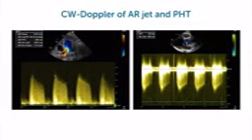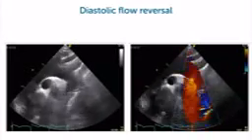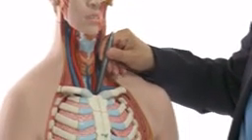The shape of the spectrum of aortic regurgitation plays a role, and also what we call the retrograde flow that comes from the aorta back into the left ventricle, which can be assessed by a view which is called the suprasternal view. We just want to show you this view because I think this method is a very important one, and even though it's something which is only more for the experienced user, I think at least you should have seen how it works. And as the name says, we're imaging from above the sternum. So we'll be imaging from right here, looking down towards the aorta.